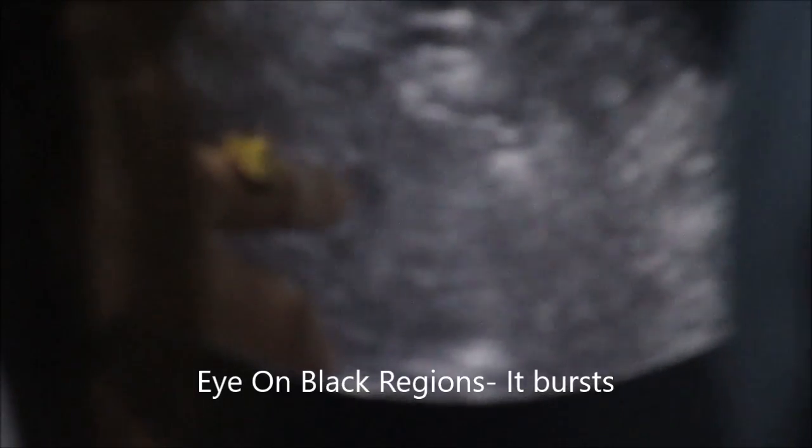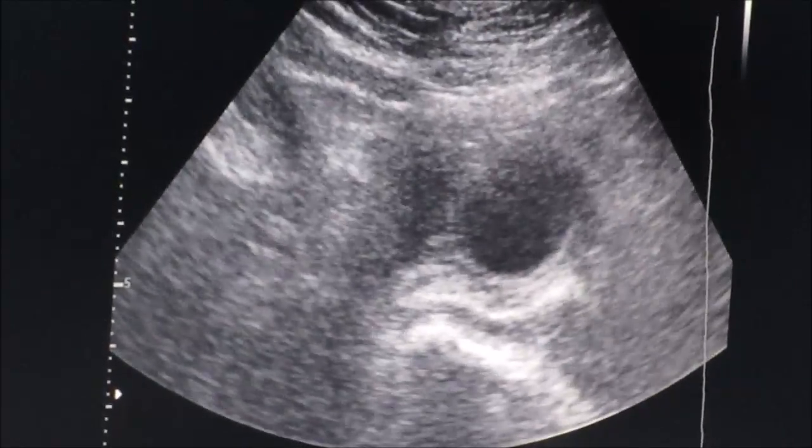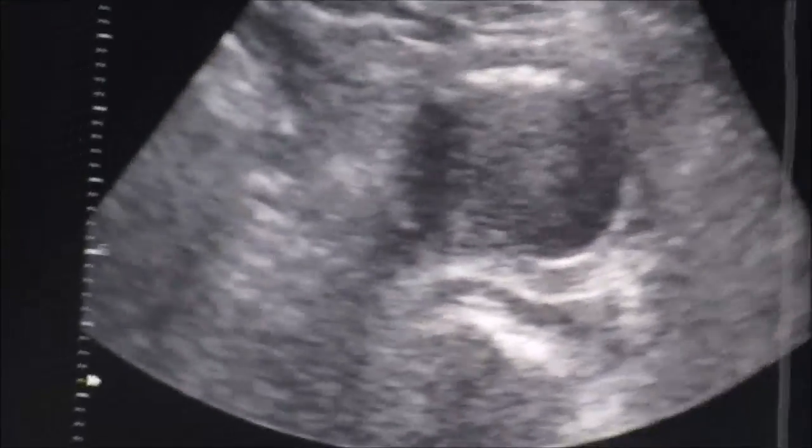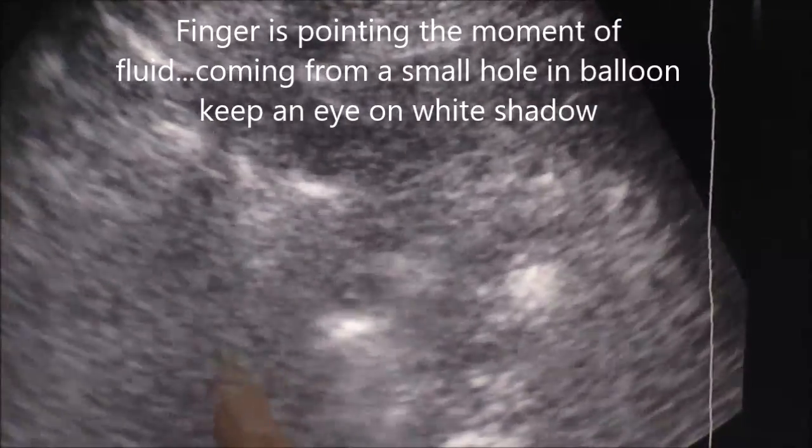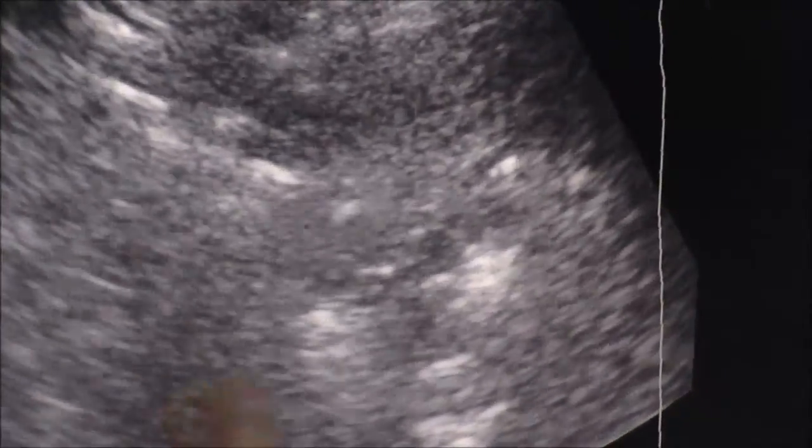Hi friends, so here you can see in the ultrasound there is a bulb of Foley's catheter, and this is a retained catheter. Usually a Foley catheter should be inflated with distilled water, but if we use normal saline after a few days it crystallizes.